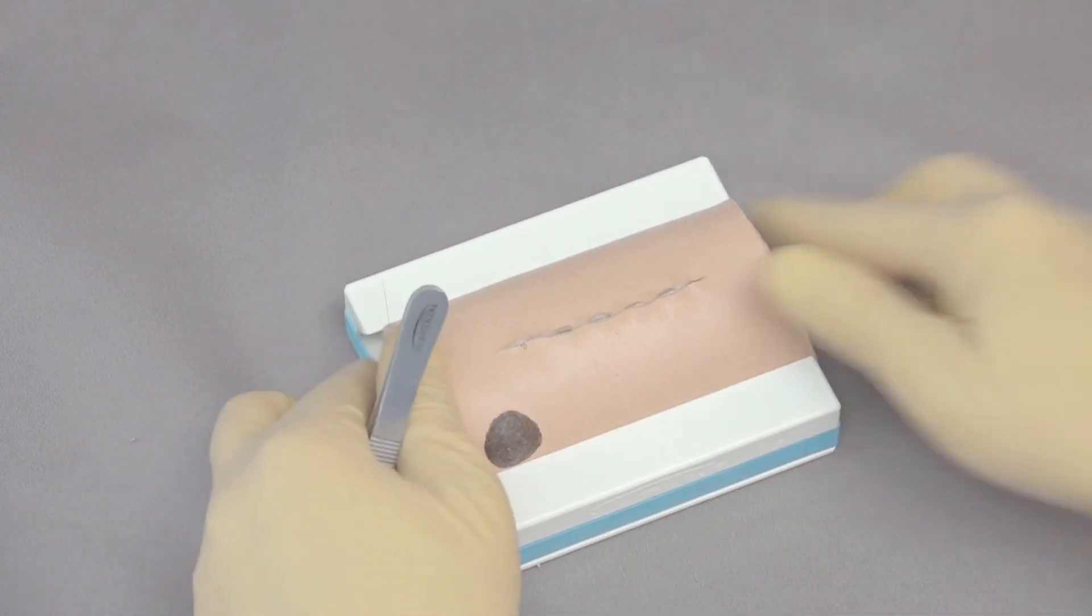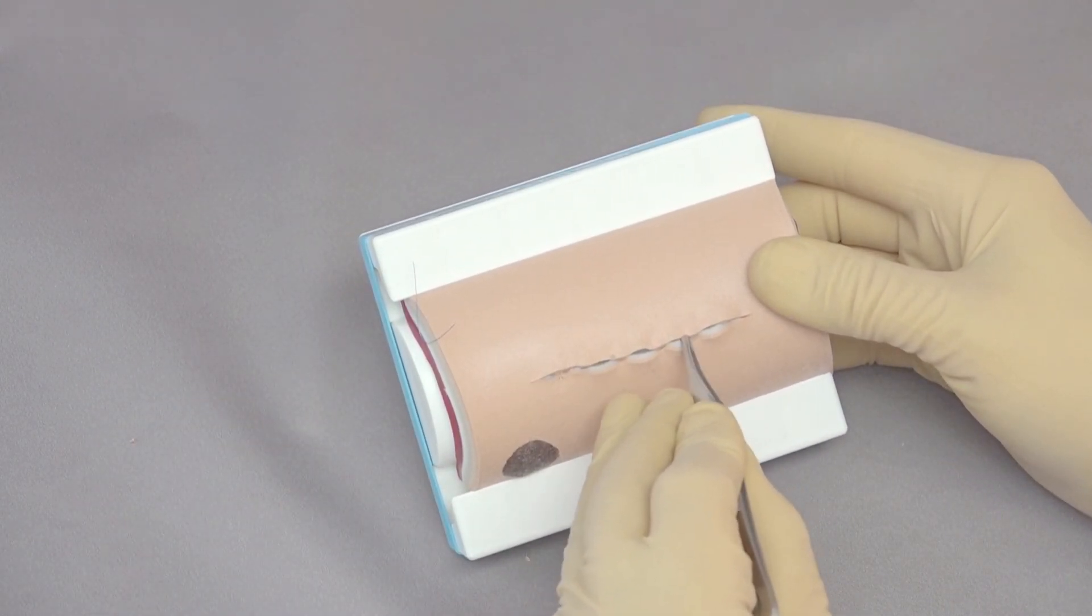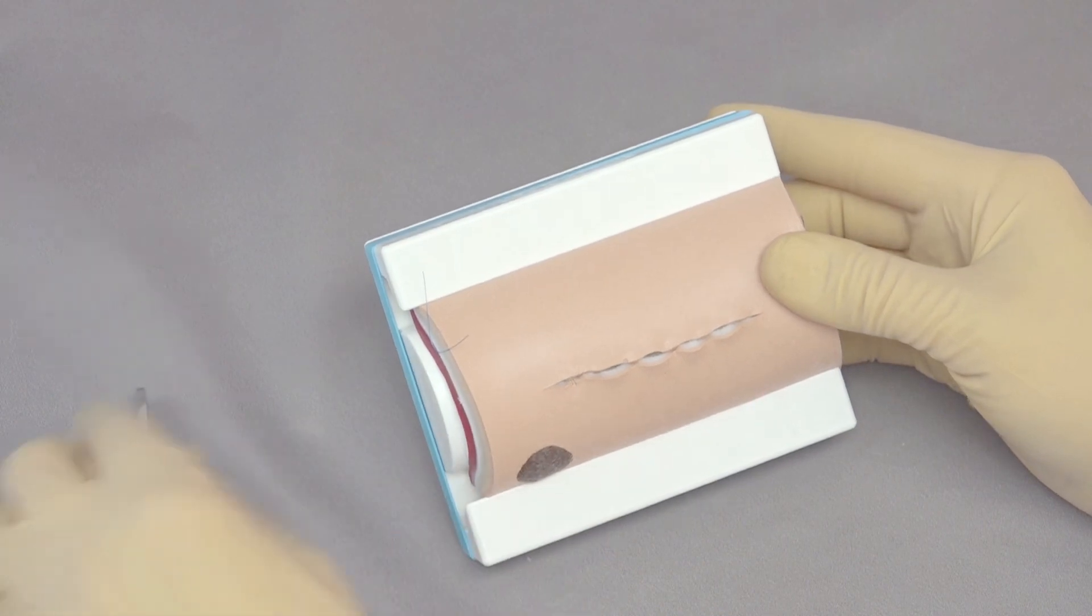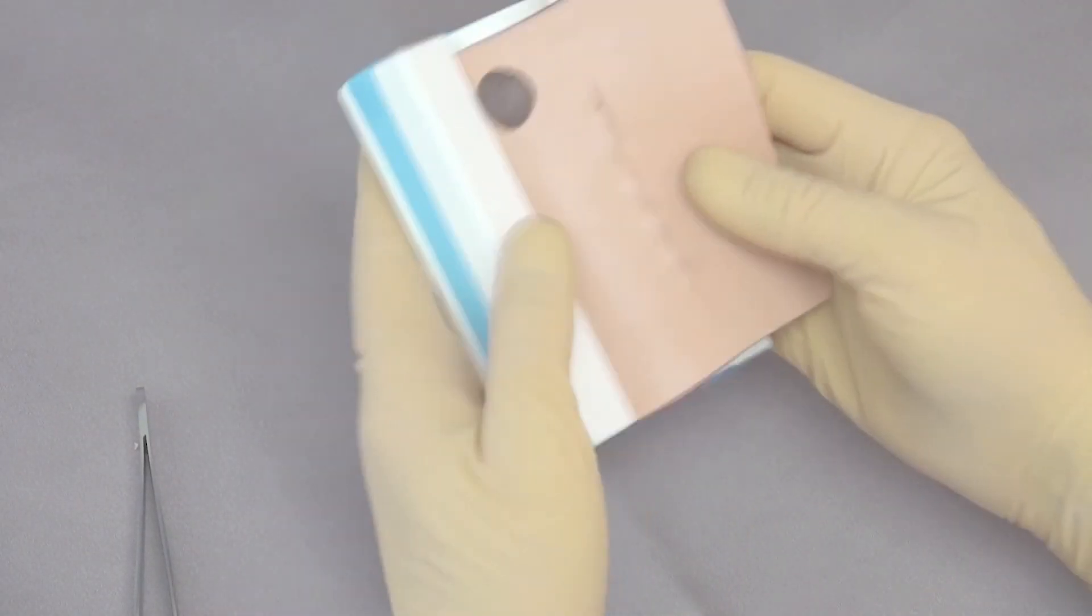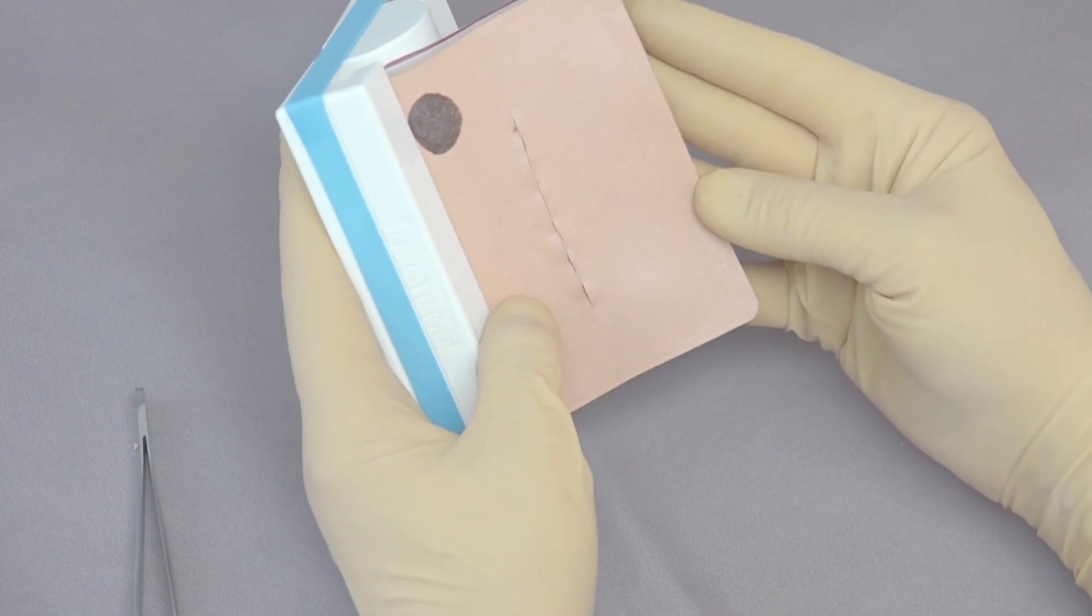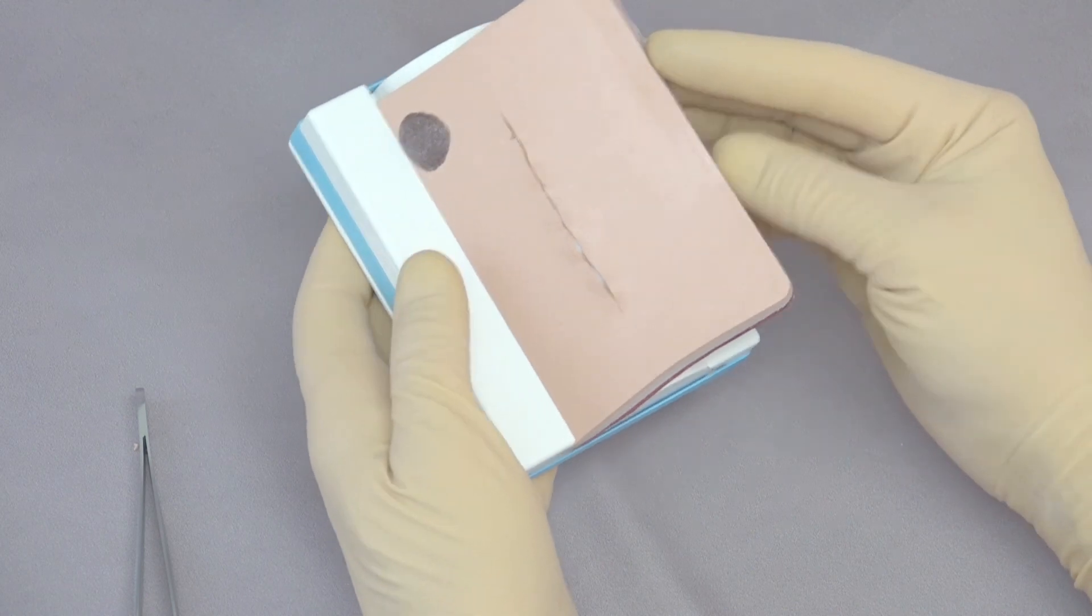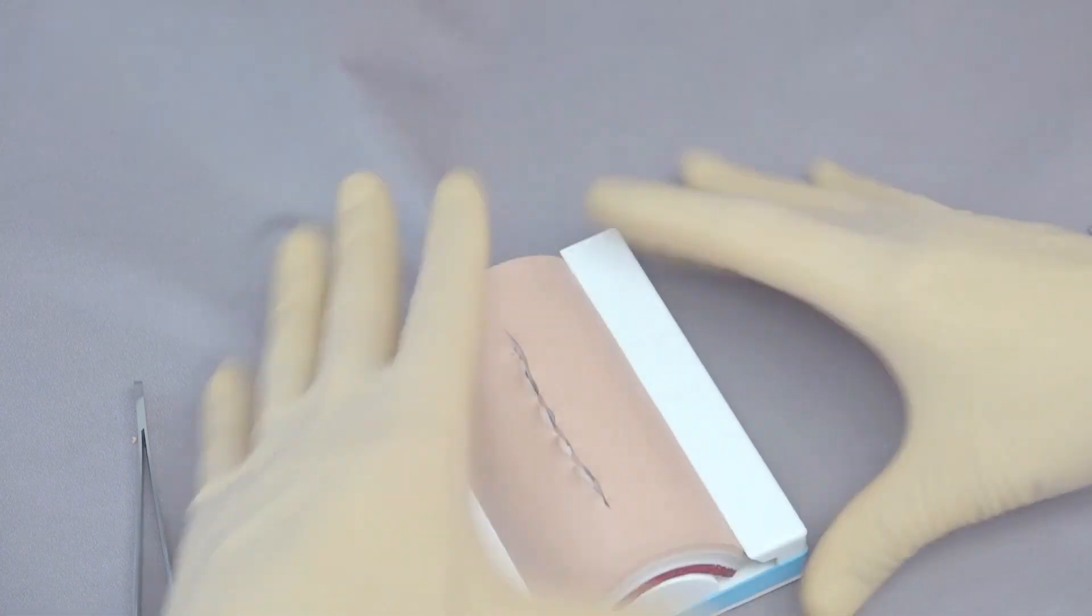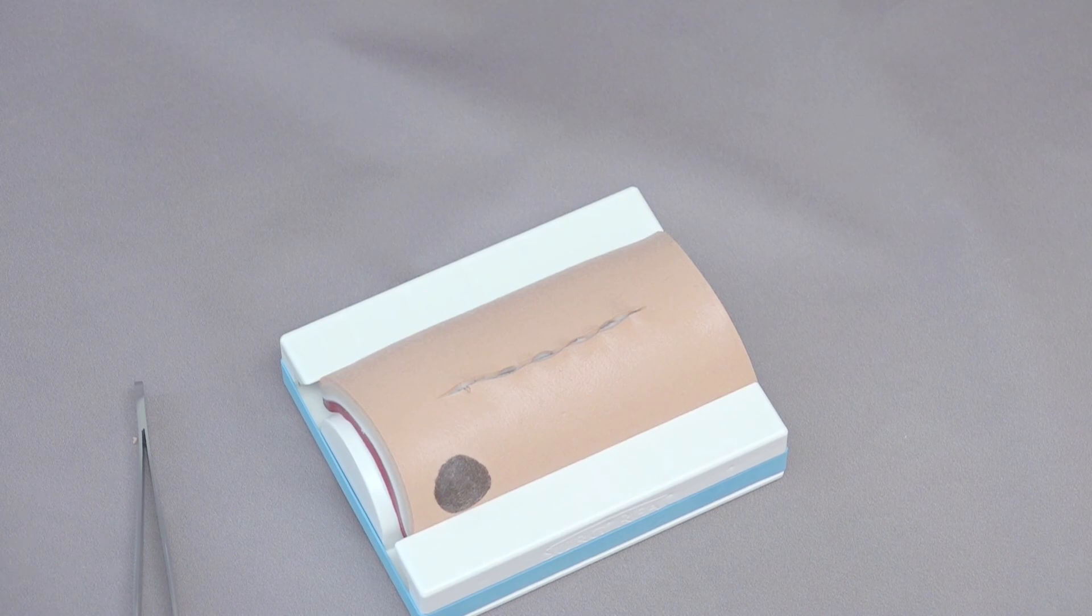As we look at this, I can evaluate and critique my suture line and realize that these bites were good because I didn't go very far there. But I went too far on this side. So this side was good, this side was too far. So I took a little bigger bites there. But yet if we pull this out and we don't have the tension base on it and watch it come together, you can see again that it opposes pretty nicely. But my bite depth was a little different. So the beauty of these pads is that I can now look at this and go, there's more to learn. I can do a better job the next time. So let's go ahead and we can pull the sutures and start all over.